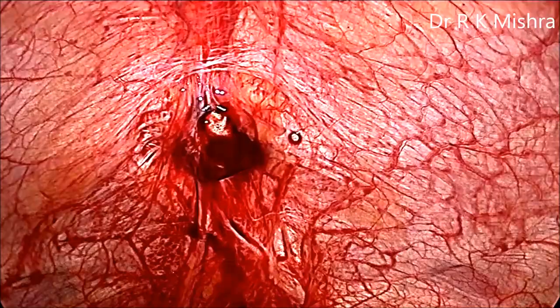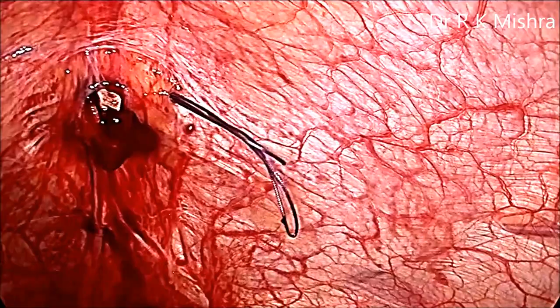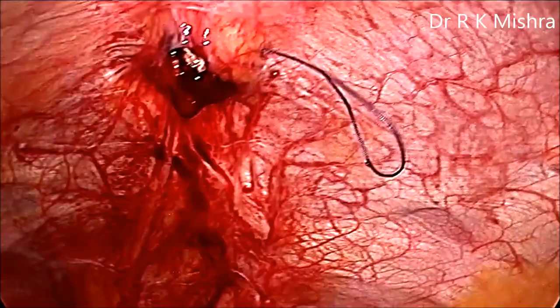This is a Veress needle technique for port closure. Port closure can be done by making a loop by removing the stylet of the Veress needle and feeding a suture, then reintroducing the other suture. This technique is very good, very convenient, and very economical.